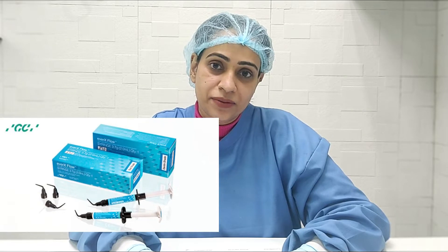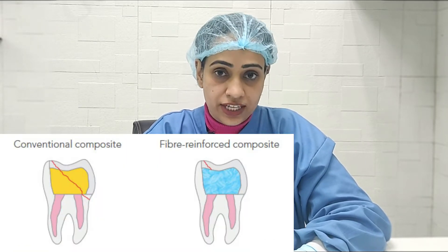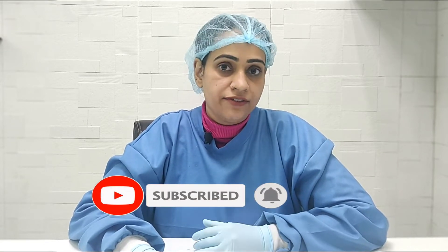EverX is a material by GC which is a bulk fill material. It has fibers reinforced into the resin matrix, and it has a very high fracture strength. That's the reason why it is really advisable for huge cavities. My personal favorite use is for pre-endo buildups and large class 1 cavities where I get really tired with the layering of conventional composites.